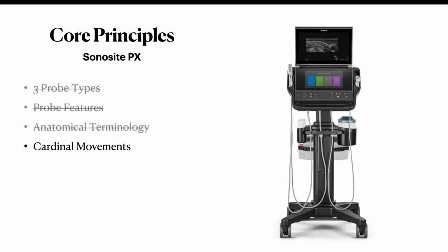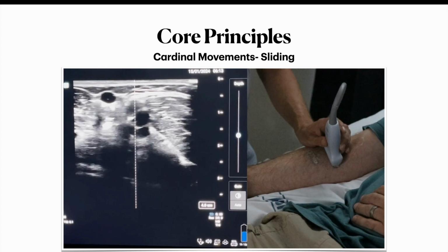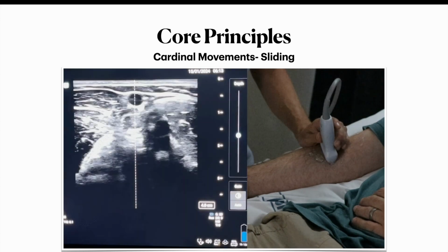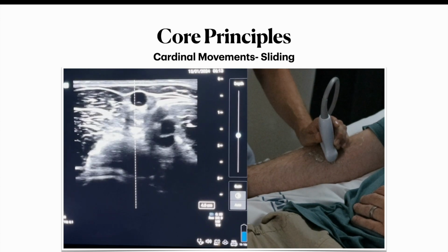And finally, there are 3 cardinal movements that you will need to know. These are known as sliding, fanning, and rotating. We can slide in 2 main directions. One is horizontally in a medial to lateral direction, and the other is vertically in a proximal to distal direction.